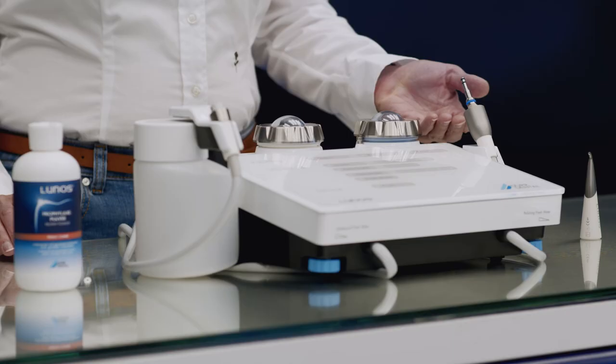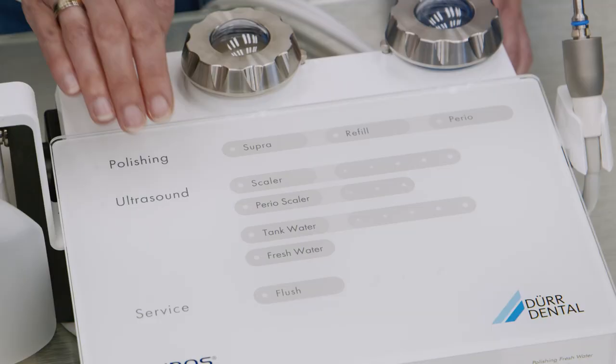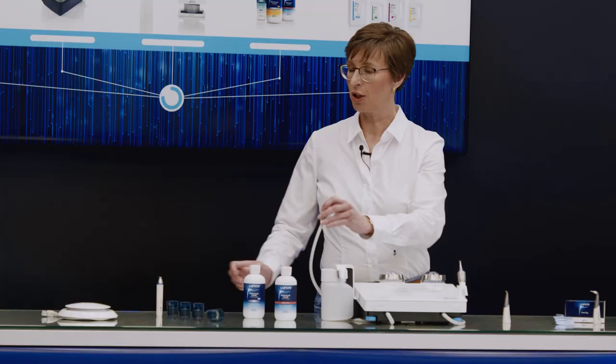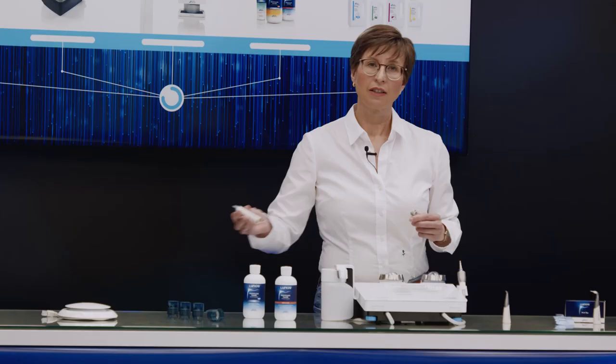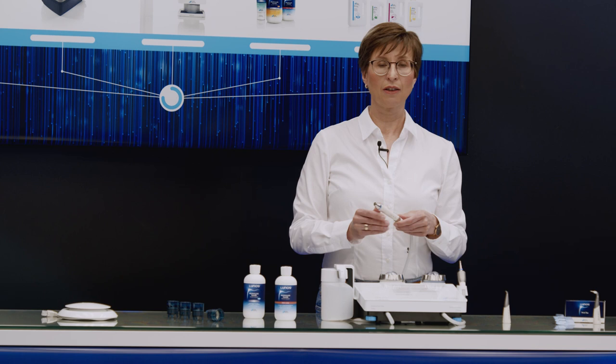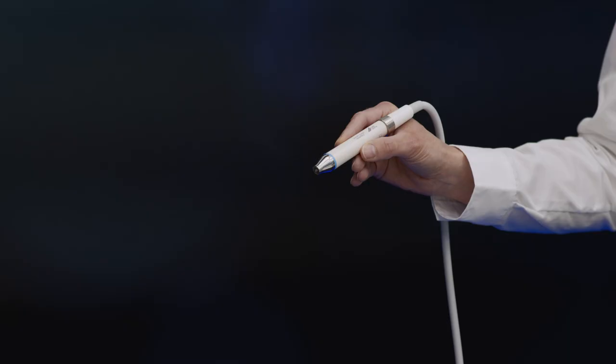In addition to the range of functions for polishing treatments, the device also offers functions for ultrasonic applications, referred to as ultrasound on the device. The scala handpiece is particularly slim and lightweight, allowing for ergonomic and fatigue-free working. The all-round lighting ensures that the working area in the patient's mouth is perfectly illuminated.